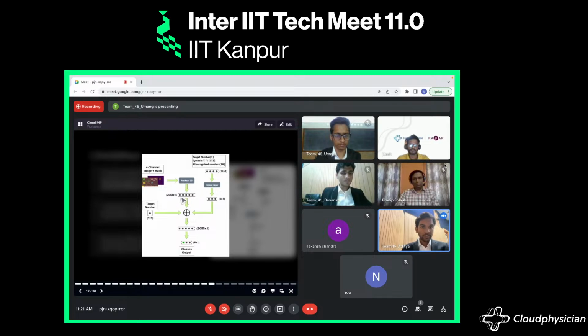This feature vector is concatenated with another vector of size 14. This vector consists of the number to be classified, associated symbols like brackets and slash, which are generally found with BP readings, and all other numbers on the screen. This size 14 vector is passed through a linear layer to get an output of size 6. This size 6 output, along with the number to be classified, is again concatenated with the 2048 size feature vector to get a vector of size 2055, which is finally passed through a fully connected layer to get our 6 classes.